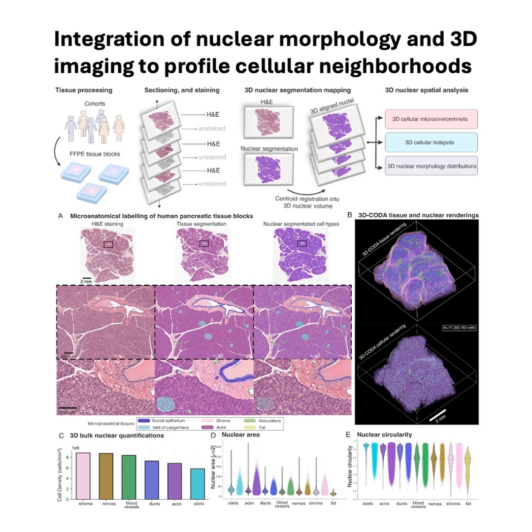Identifying millions of nuclei sounds tough. It performed very robustly. They reported F1 scores, which is a measure that balances precision and recall, of around 0.89, 0.84, 0.80 on different test sets, which basically means it did a very good job, high accuracy, in finding and outlining individual nuclei across the board. So it found pretty much every nucleus correctly. With high confidence, yes, guaranteeing we're seeing each cell in its proper place. And then you mentioned earlier getting information from each nucleus. Right.